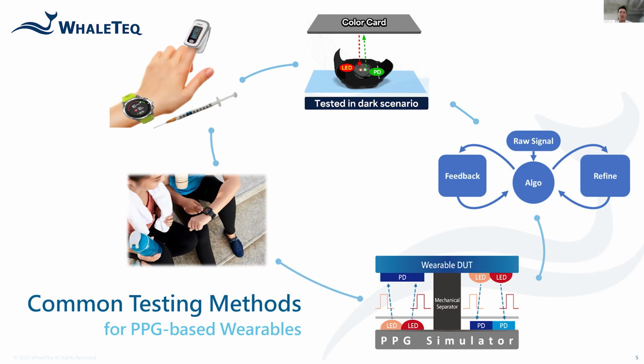And there is system verification, using an optical simulator that behaves like human tissue or a human finger for various scenarios. This is highly effective for sure. You don't need to take the big risk of a clinical trial; you just run it in your lab and make sure your electronics are working well, and then you start to approach the readings towards the actual clinical readings.